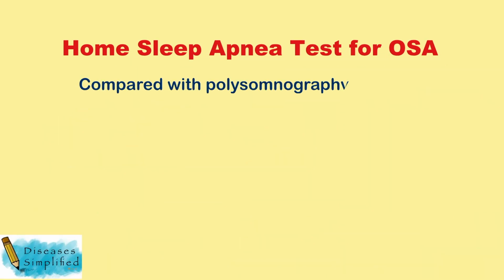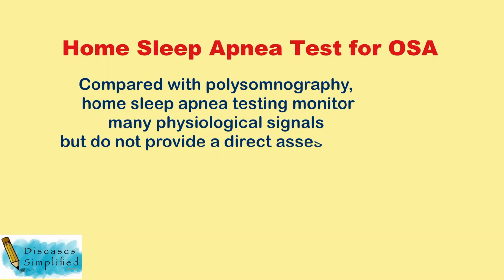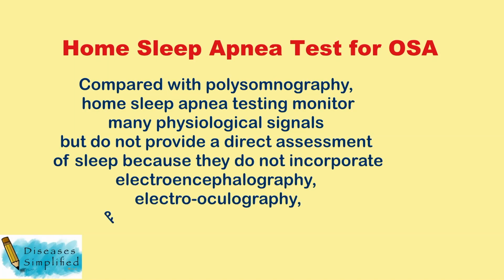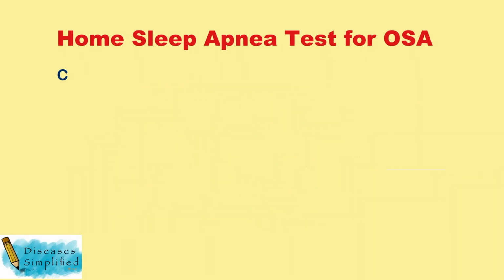Compared with polysomnography, home sleep apnea testing devices monitor various physiological signals but do not provide a direct assessment of sleep because they do not incorporate electroencephalography, electrooculography and surface electromyography.